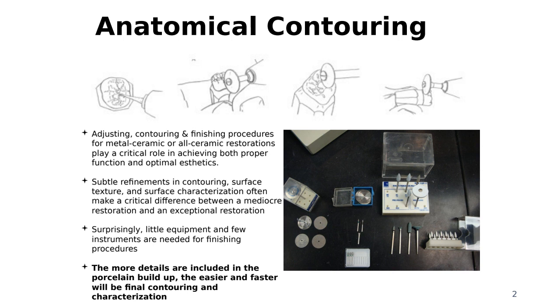And then to achieve a greater success of the case and to copy nature, we have at our disposal different types of porcelains to match and mimic the natural conditions of the patient. And it's very important for us to understand especially those materials, the porcelain, the ceramic materials.